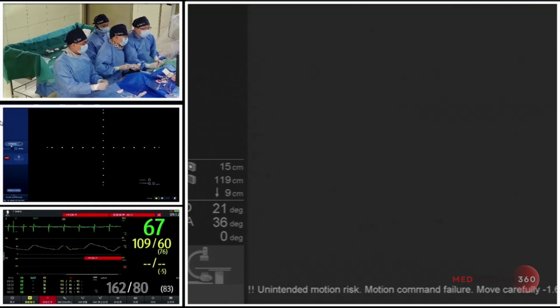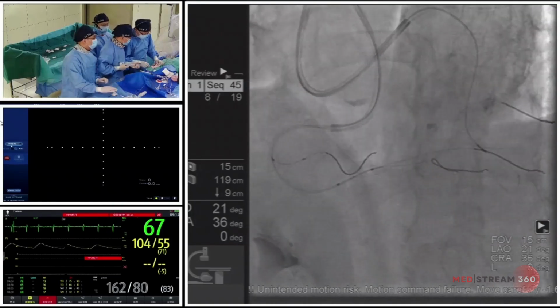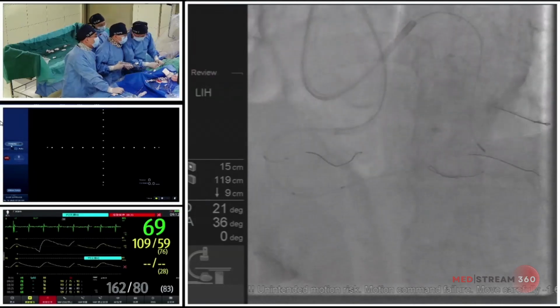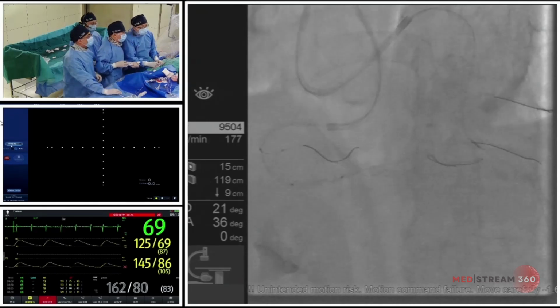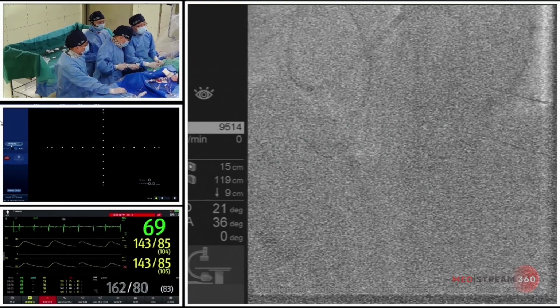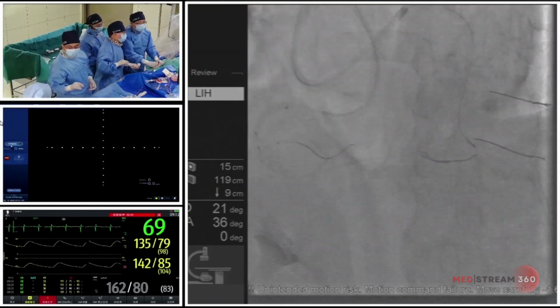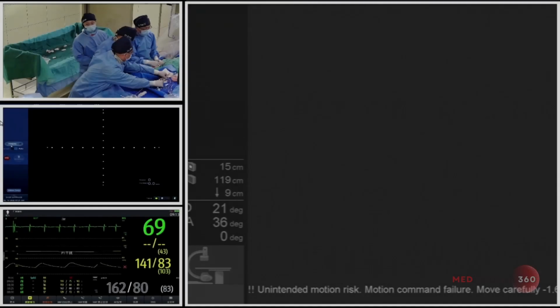Actually, there is a very interesting result from a previous manuscript: compared with true-to-true lumen stenting, subintimal stenting showed no obvious difference in cardiac death, target lesion revascularization, and myocardial infarction during follow-up in CTO cases. So we do not have to worry too much about subintimal tracking, as we just mentioned, within the vessel architecture theory. Compared with the true lumen strategies, there is no obvious difference in those outcomes. IVUS, please, yes.